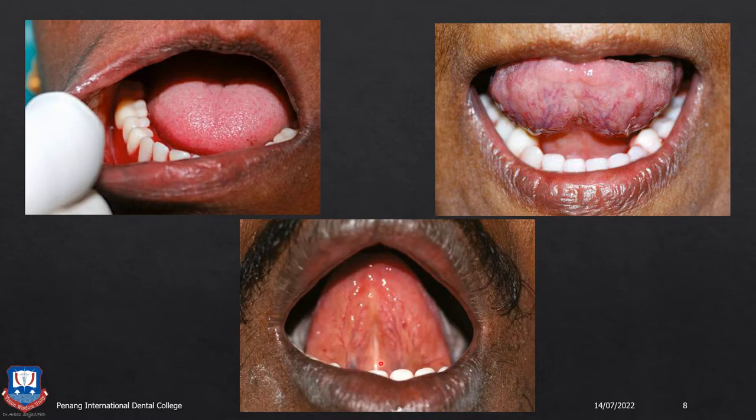You have to check for the lingual frenum relief, especially here in the Penang area, as what I have seen in the past 2 months is that most of the patients have a very high frenum attachment, or something similar to a tongue tie. So you have to give extensive lingual frenum relief for the stability of the denture.